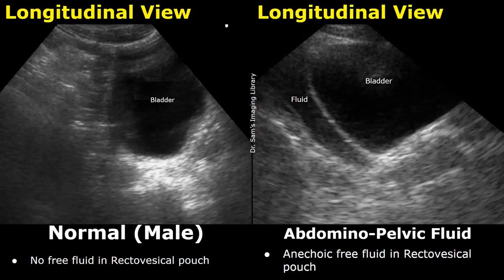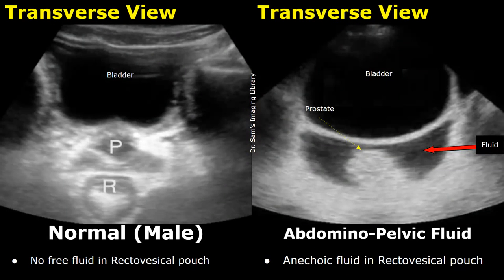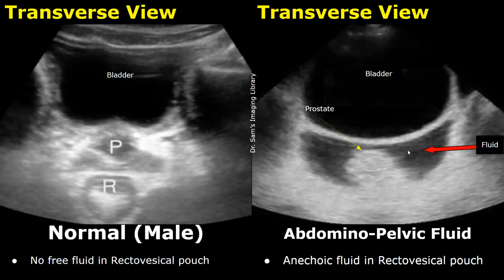These images are taken in the transverse plane. In the normal image, we can see the prostate and the rectum without any fluid surrounding them. But in this image, we see anechoic fluid posterior to the bladder, and the fluid surrounds the prostate.